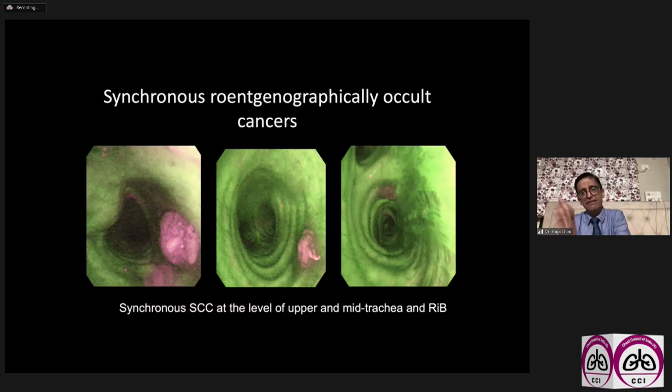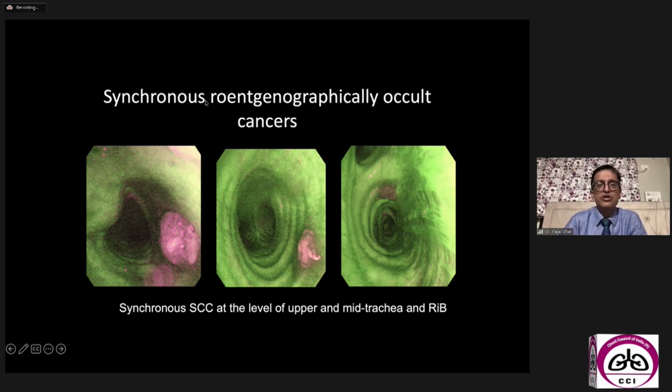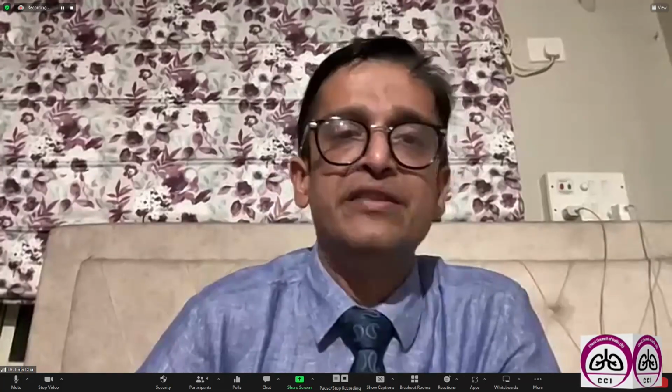We've spoken about various modalities that can be used with cryo. We started off with the use of cryo for biopsies of various descriptions. We talked about transbronchial biopsies, thoracoscopic biopsies, and endobronchial biopsies. We talked about the use of cryonecrosis in restoration of the patency of stenotic lesions. We talked about early lung cancer and ablation of tumor in early lung cancer by means of cryo. And we spoke about the use of cryo in EBUS needle biopsies, which is what Chetan will speak about now. So over to Chetan.